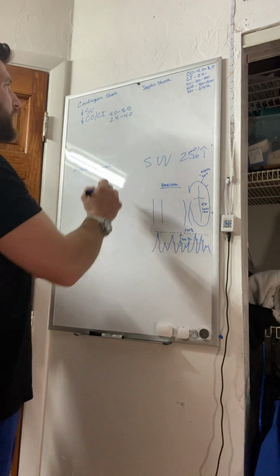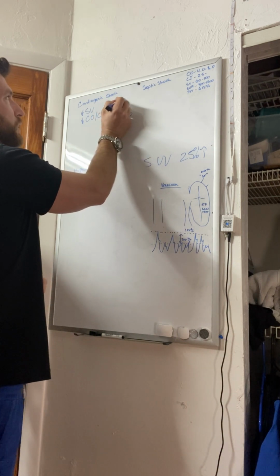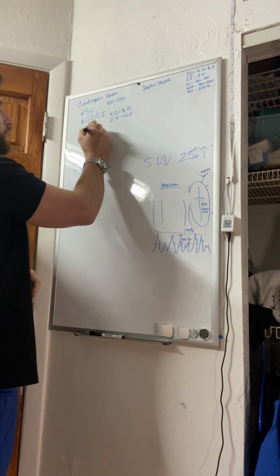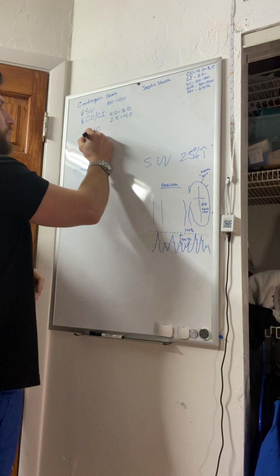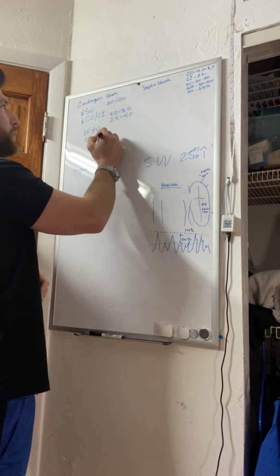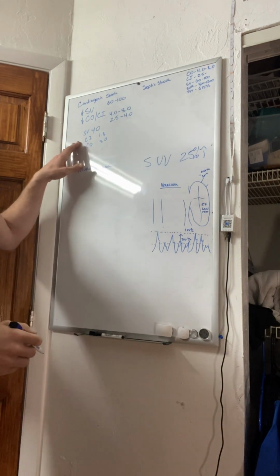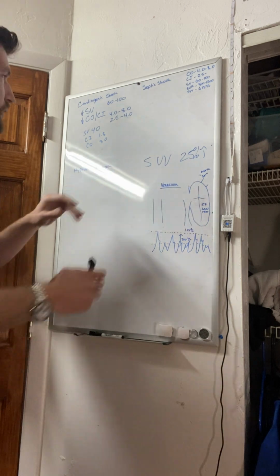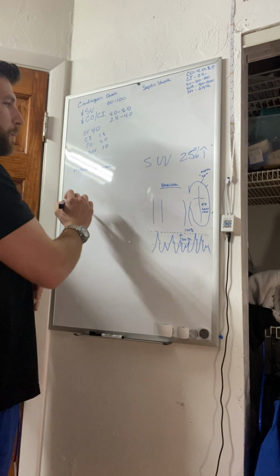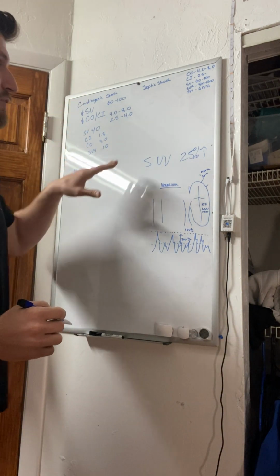So if this person has a cardiac index that's low and their stroke volume, normally 60 to 100, is less than that, let's say they have a stroke volume of 40, and that makes their cardiac index like 1.8 and their cardiac output like 3.0, but everything else is relatively normal. Let's say their SVV is 10, but there's an equation that occurs with SVR, right?